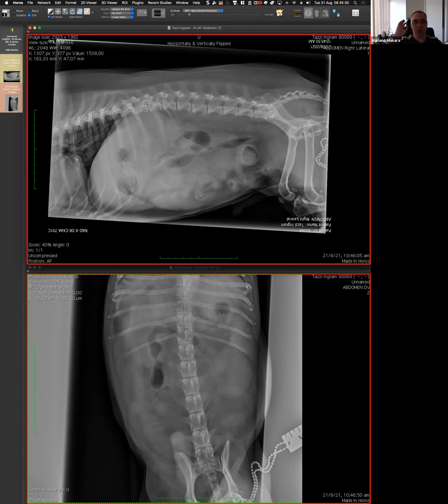It's a vomiting dog, so they are just about answering that question. And that's perfectly fine. But the risk of that approach, it's not a person, it's an approach, is that it may miss important things that are peripheral. I'm not criticizing, it's just the definition.